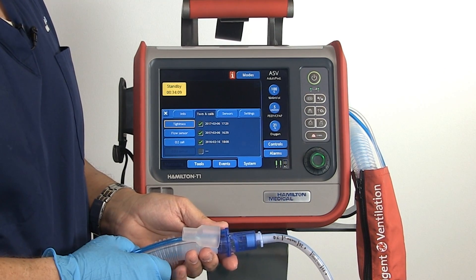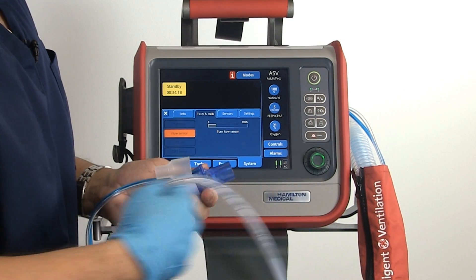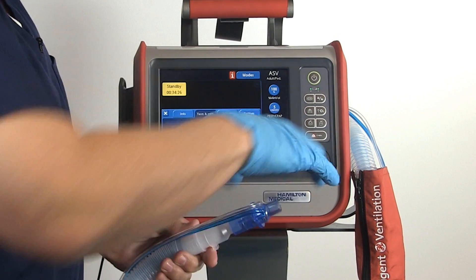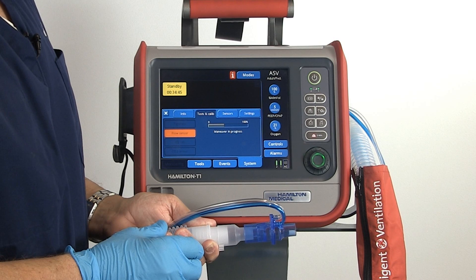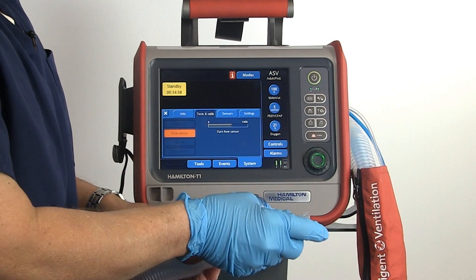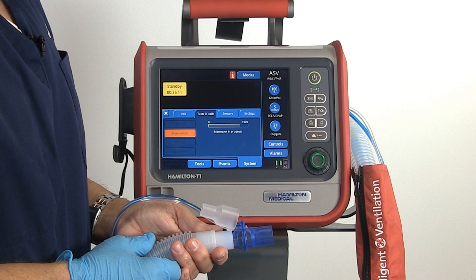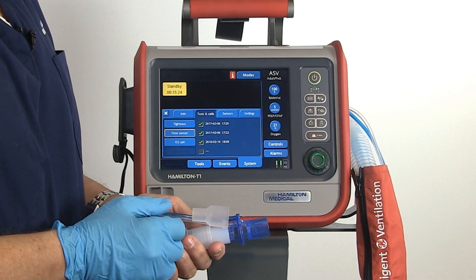Our next test will be for the flow sensor. Press the tab. You've got a connector on your flow sensor — take the connector off and turn the flow sensor as indicated by the screen. The flows will slowly ramp up. The commands say to turn the flow sensor again, so we will turn them. Remove the connector and replace it onto the circuit. We get the indication with the green check that the pre-ops are complete.